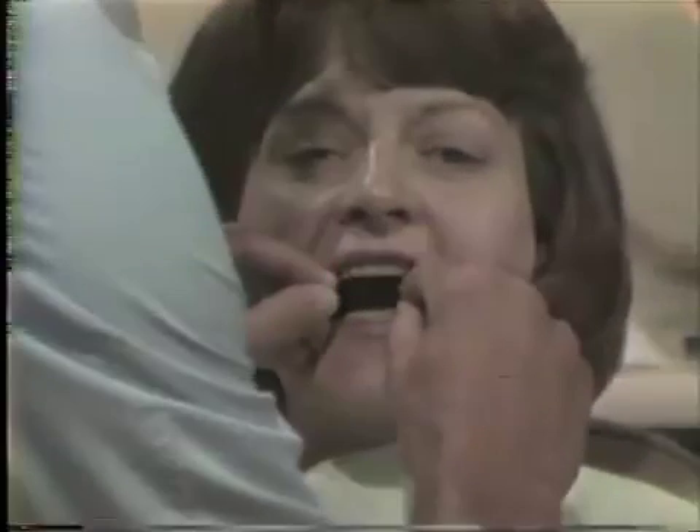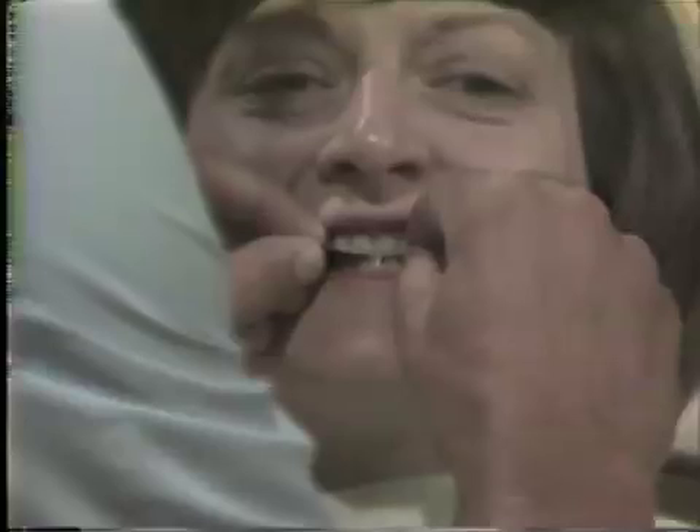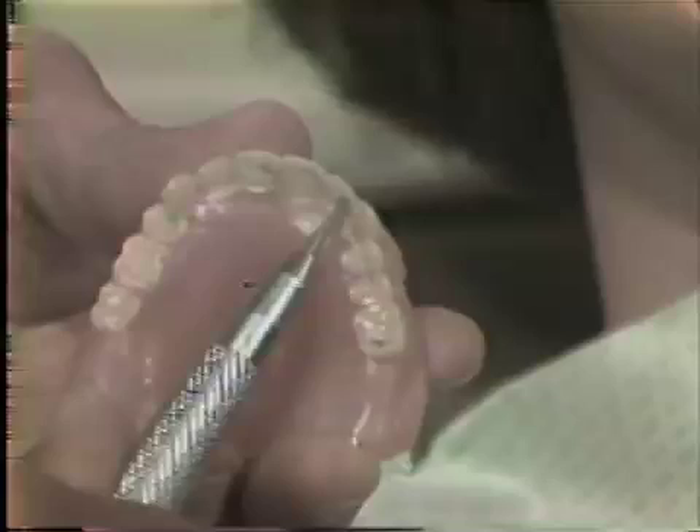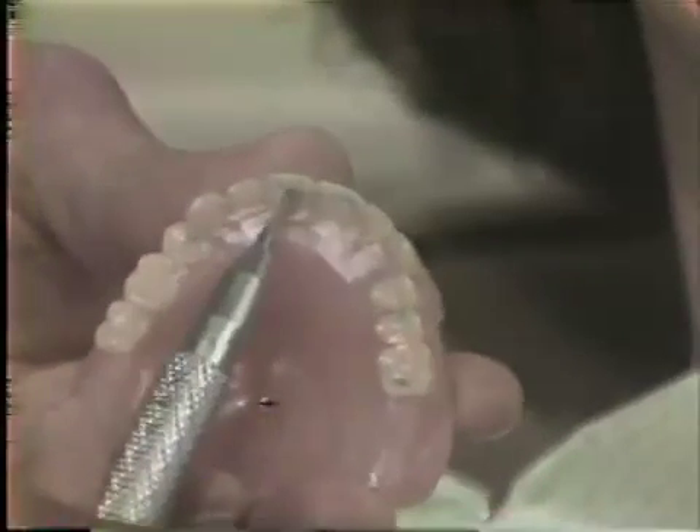When it has been decided a reline should be done, the first thing to do is adjust the occlusion. When the occlusion has been adjusted, any gross undercuts on the tissue side of the denture should be relieved with an acrylic burr. This will help the laboratory when the denture is processed.